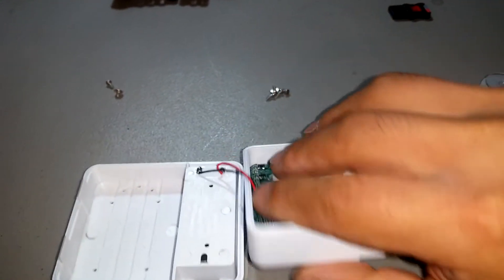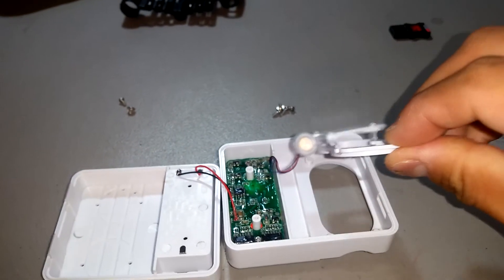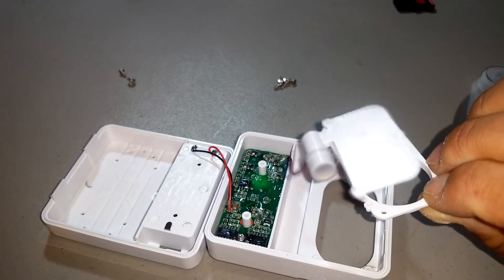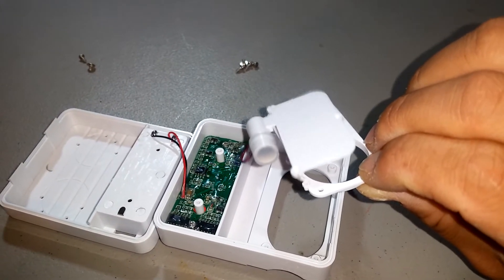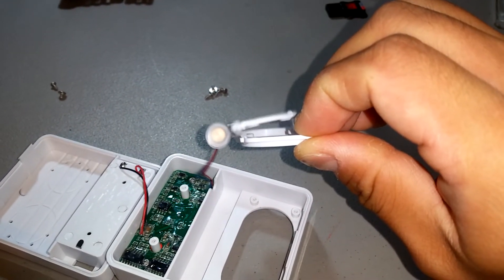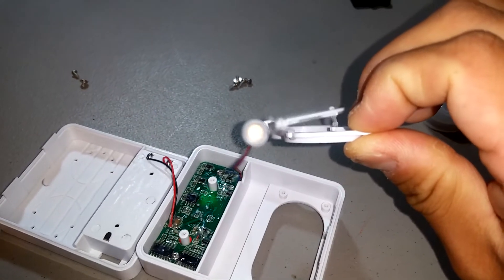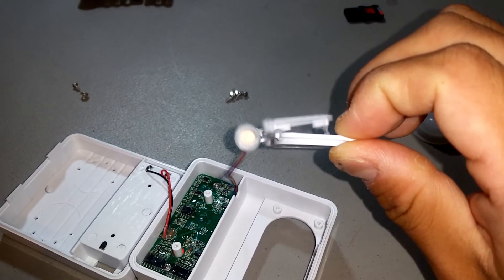I'm going to turn it on, and you can see that's the motor unit, and it's turning and it's vibrating. It vibrates this platform, and this platform is what this sits on, and so the silicone vibrates and basically rubs against the lens and cleans deposits off.